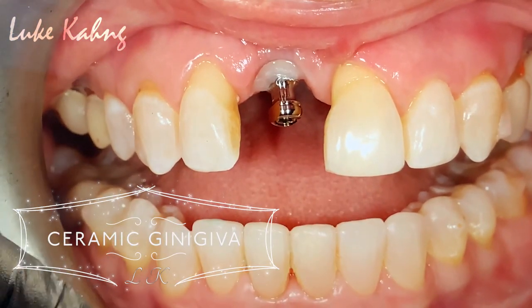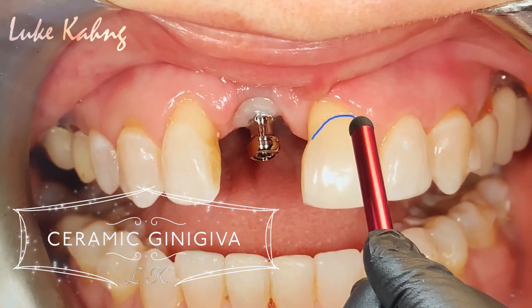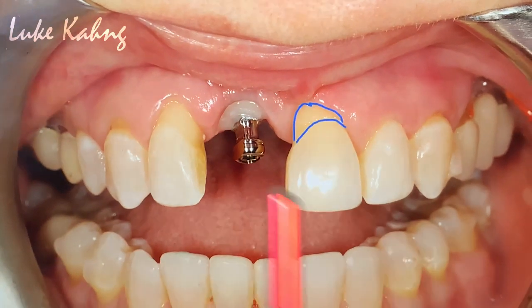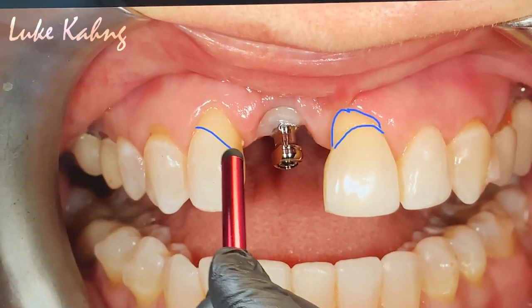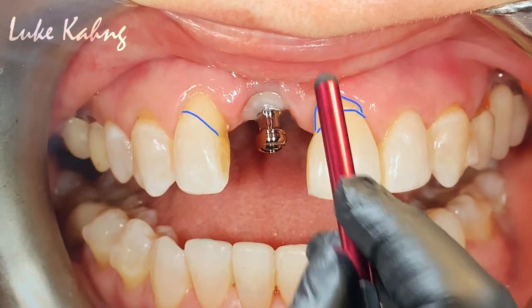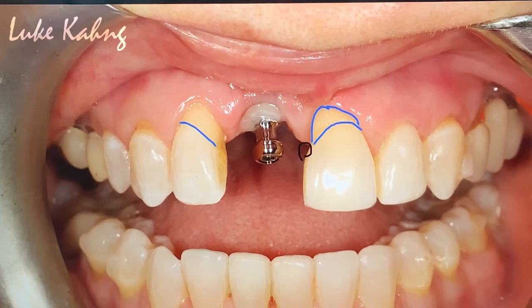Single crown, the top. What I'm talking about is here. This is a root exposure. Root exposure, so I have him do. The other problem is the black triangle here. We're trying to get rid of this.